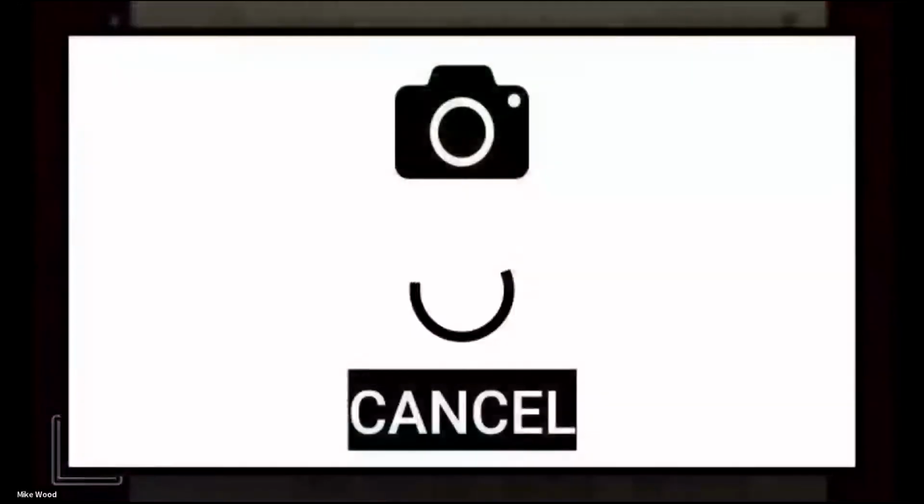So what you're going to do is hold this up over that, and I can then hit the snapshot button. I was out of focus, sorry. There we go. I wasn't looking properly. So now I'm going to hit that snapshot button.